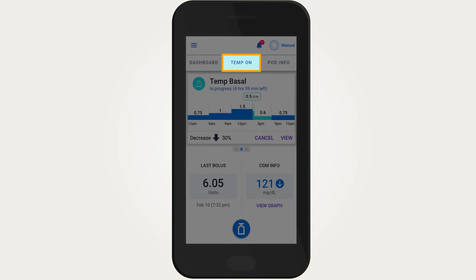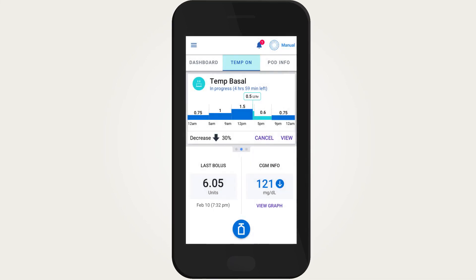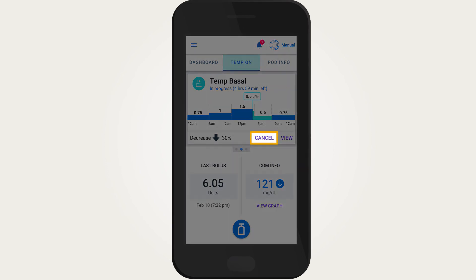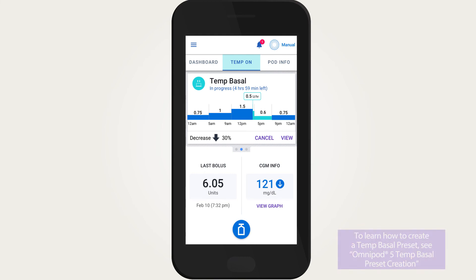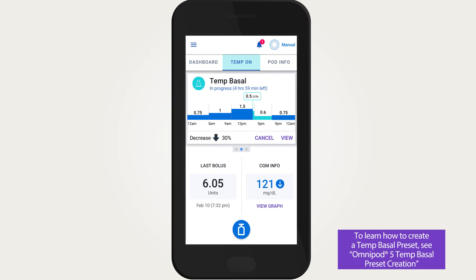If a temp basal rate needs to be cancelled before the scheduled time, tap the 'Temp On' tab and tap Cancel. If there are temp basal rates that are often used — for example, for a weekly exercise class — creating temp basal presets can be convenient.